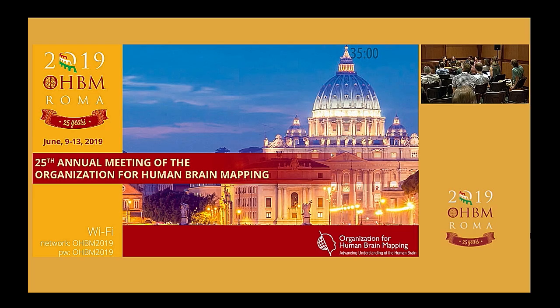So I would strongly recommend, for data that show more motion than you would usually tolerate, for example, you have a resolution of 1.5 millimeters and you really see motion more than the voxel size, let's say 1.5 or 2 millimeters, to really check your data with respect to the artifacts that are driven by that motion. Because the motion itself can often be corrected, but it's often the secondary artifacts that come with the motion that really produce the problem in your data. There are technologies that you can try to correct those secondary artifacts, but it also depends a little bit on the kind of data you have.